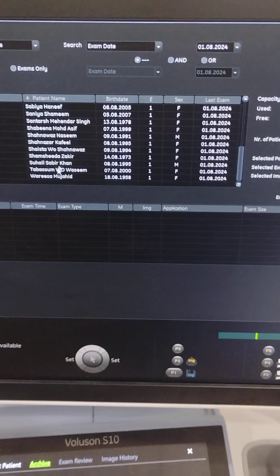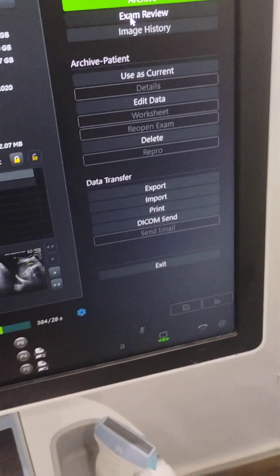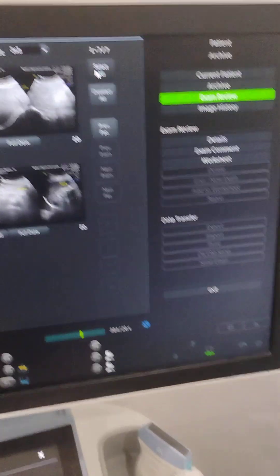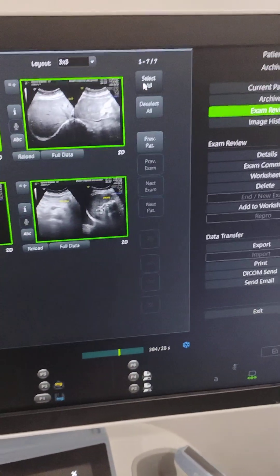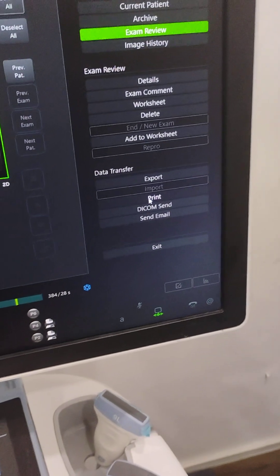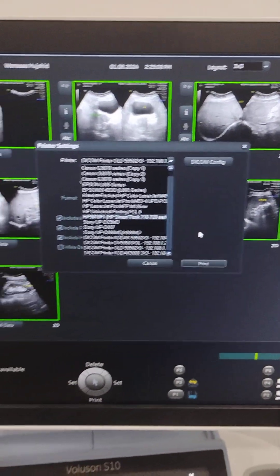Suppose we have to review the exam of a patient — you just go here and select exam review. And if you want to print the ultrasound images, then select all, and then you are just about to print. Then select the printer — whether it is a DICOM printer or a photo printer — and then just print the whole images.